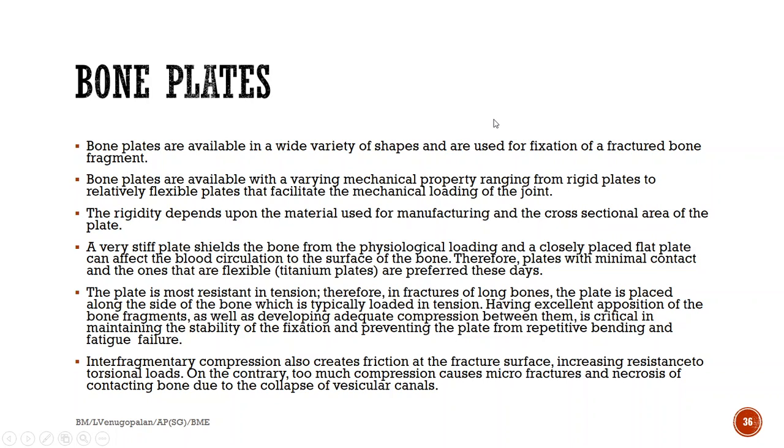We have discussed fixation devices in the previous video where we spoke about pins, bone pins, or to be precise, bone wires and bone screws. So moving on, we shall discuss bone plates today, which is also another type of fixation device. Bone plates are available in a variety of shapes and are often used to fixate a fractured bone fragment.